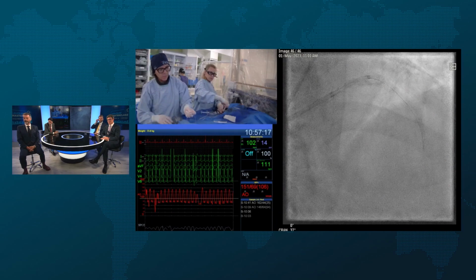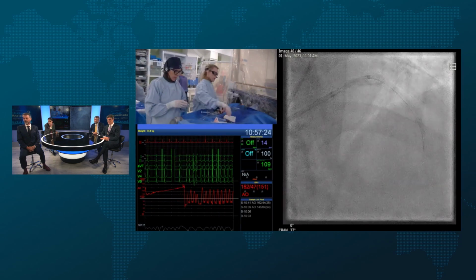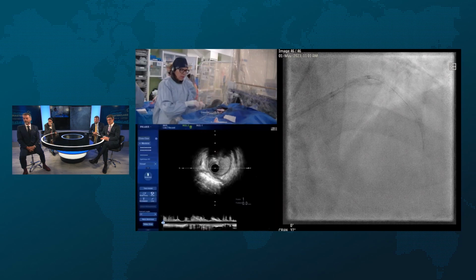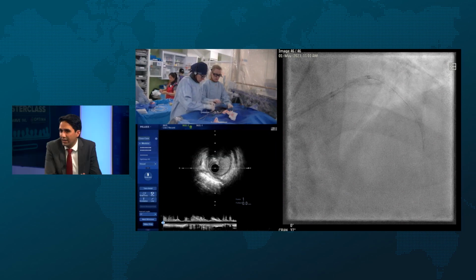The only thing I would say is that your NC balloons are significantly undersized proximally. Yeah, that's the point we just made. Just have a look with the IVUS, and then we may need a bigger one, especially for the ostium of the LAD. Definitely. But I'm not sure you need that now, right? You've definitely cracked it. The wire's in the middle of the balloon.